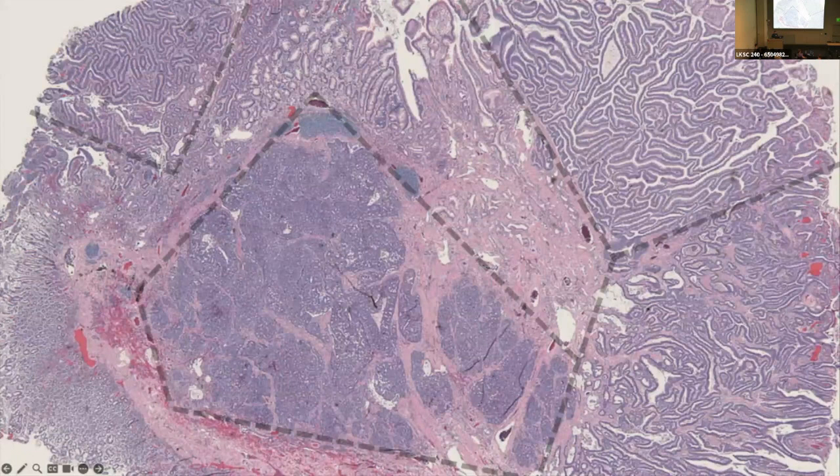Yeah, so that's a great question. Every specialty has its own sets of structures and scale. In hematopathology, a lot of what we're looking at is floating single cells, so we're going to higher power than in a lot of solid tumor pathology, where they're 10xing a lot of that stuff. I'm routinely 20xing.